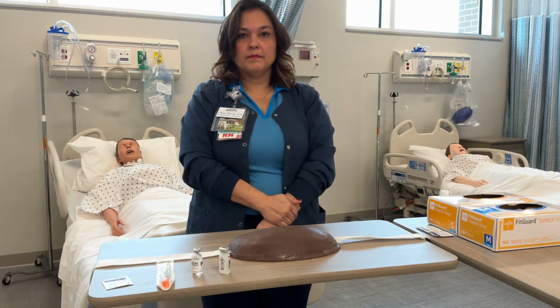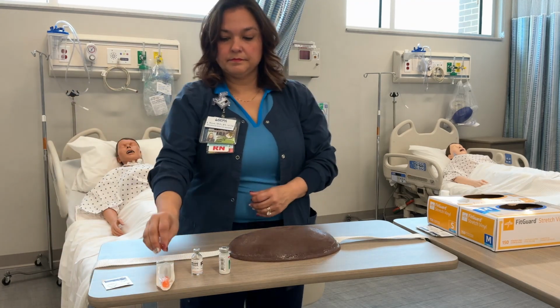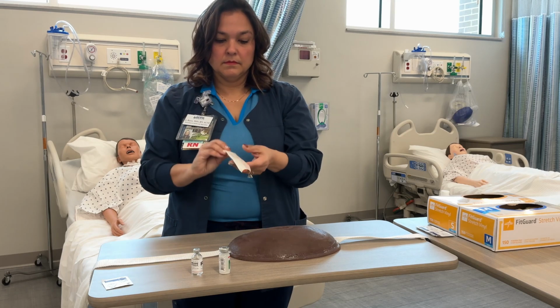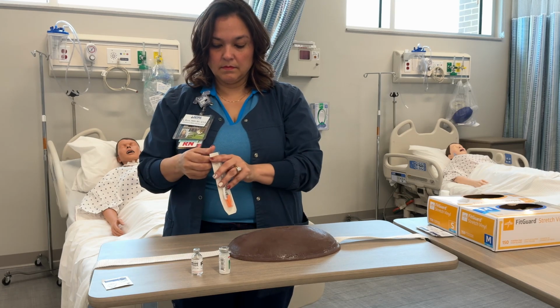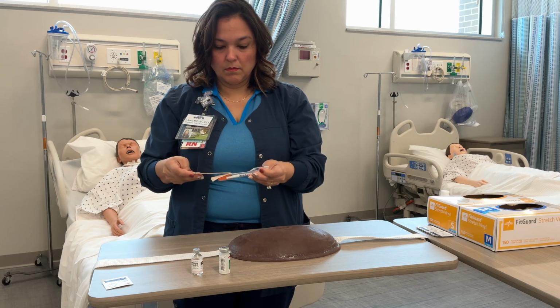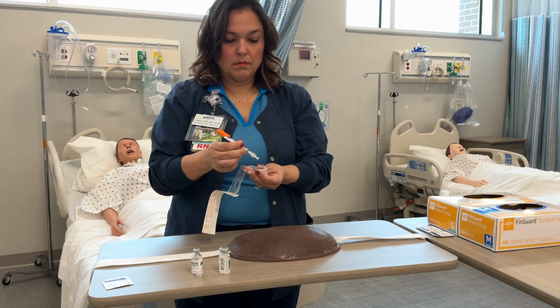We're going to select the correct syringe, gauge, and length of needle, and this will depend on your patient and their size. We're going to remove the needle cap and pull back on the plunger to draw the amount of air into the syringe equivalent to the volume of medication to be aspirated from vial 1.